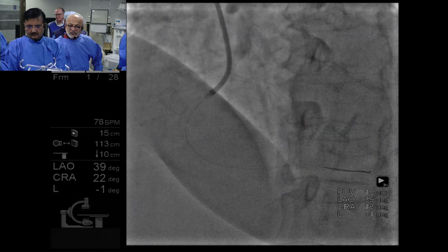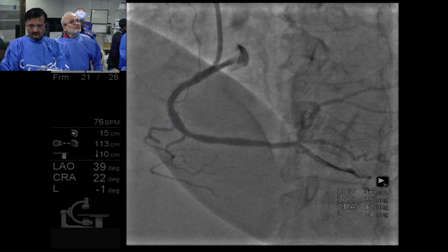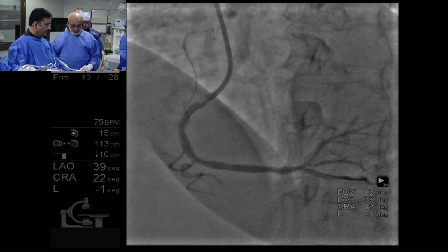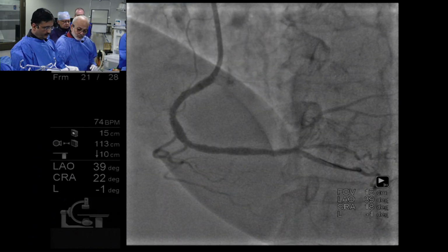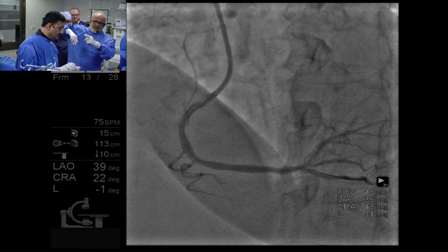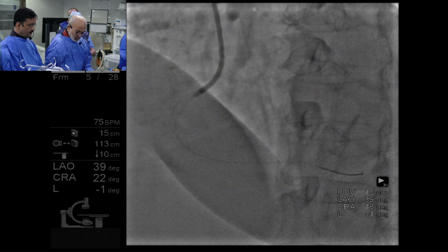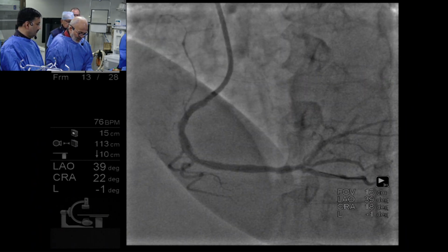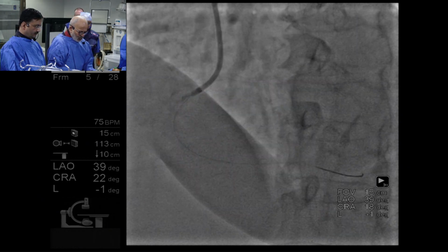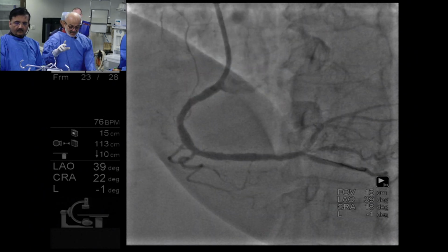Maybe Tejas, a little bit, since you have a second, your opinion on what we just talked about a few seconds ago. After you do atherectomy, when do you think it would be a good idea to do IVL in addition? It's a great question. In this case, Khaled, you saw 3 nodules in the same lesion, and none of the nodules was completely loaded, opaque calcium. They had differential calcium thickness, and we have seen cracks in every nodule.